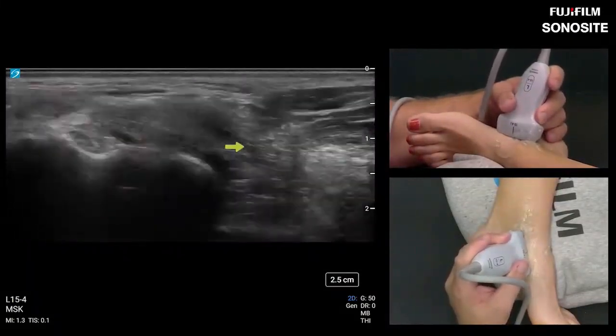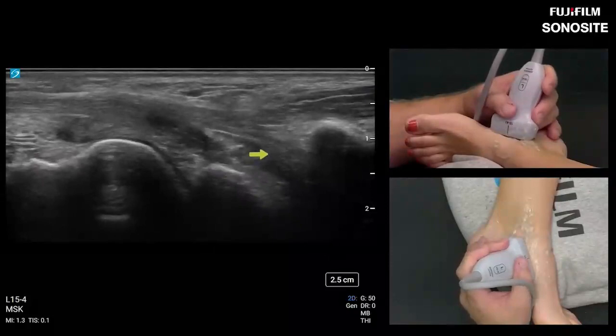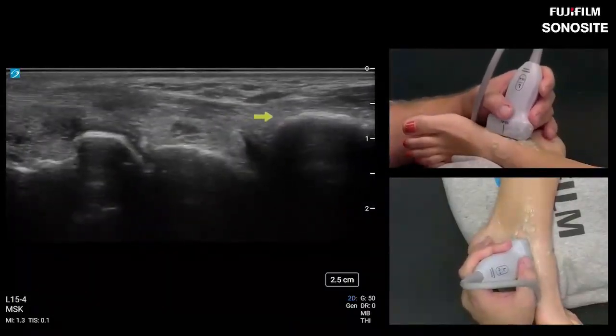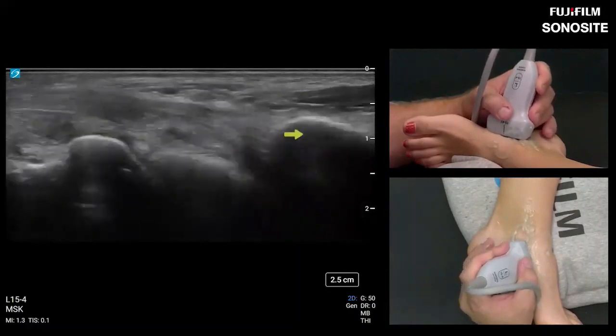The deeper branches are going to go underneath the navicular and head all the way over to the undersurface of the medial most cuneiform. And then these medial fibers, they're going to wrap around, kind of like a snake eating an egg, around the navicular.